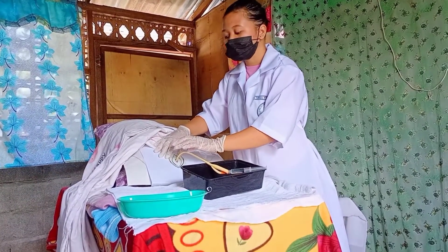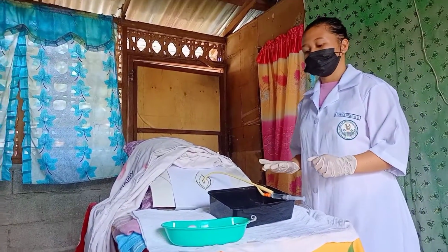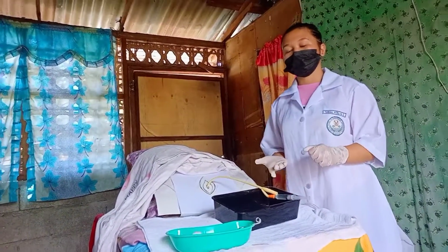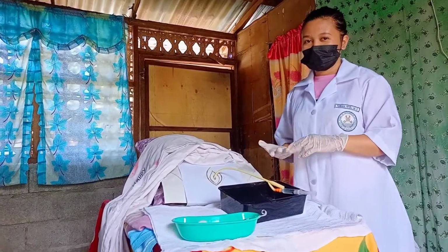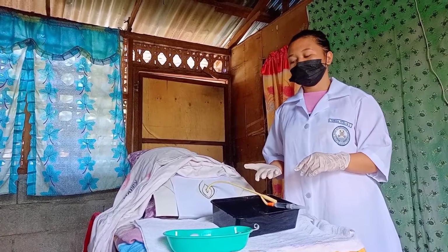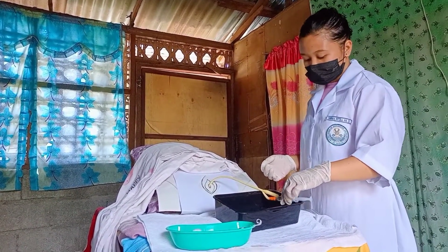Next, with the non-dominant hand, hold the labia open or the penis to hold the catheter in place. Inject the entire content of the prefilled syringe into the inflation arm of the catheter for the balloon inflation. I prepared the amount of water needed to inflate the balloon.